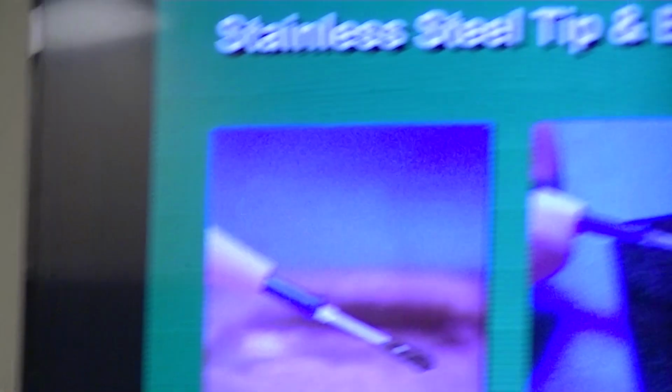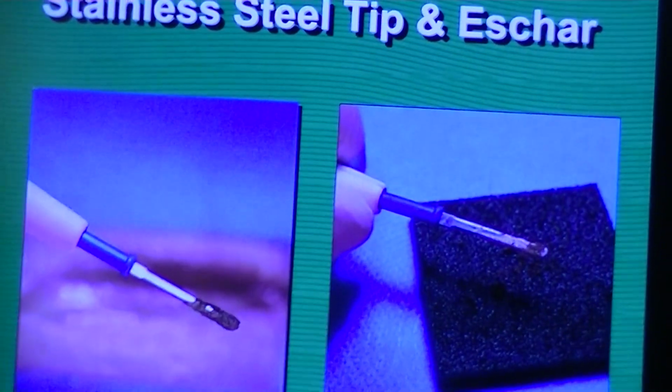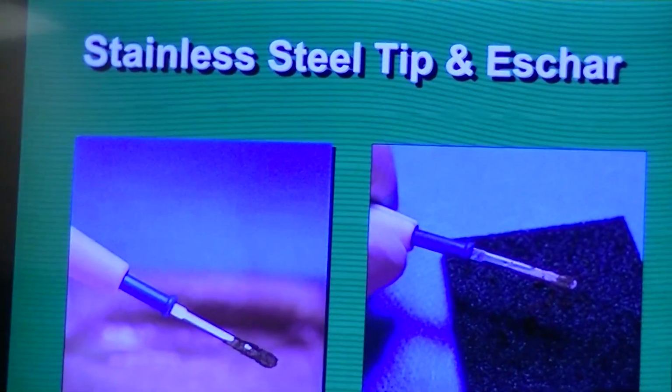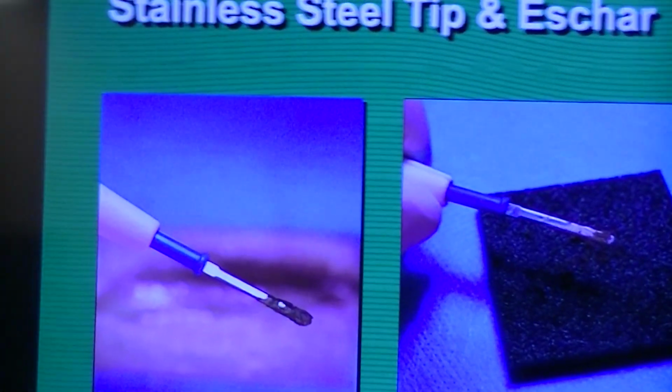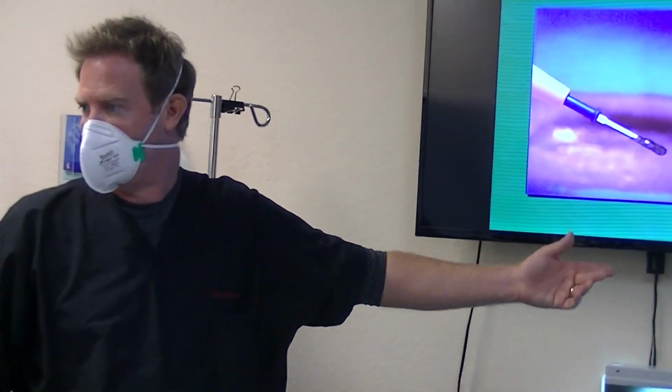So the tip just comes off, like our old one. So here it is, stainless steel. With the stainless steel, you're going to have a scratch pad to take off that eschar, because the more eschar builds up on your tip, the higher the power settings, the more jagged it also becomes. And it happens to be a fuel of your fire triad, because it's basically charred skin. Okay? Use a scratch pad to take that off.